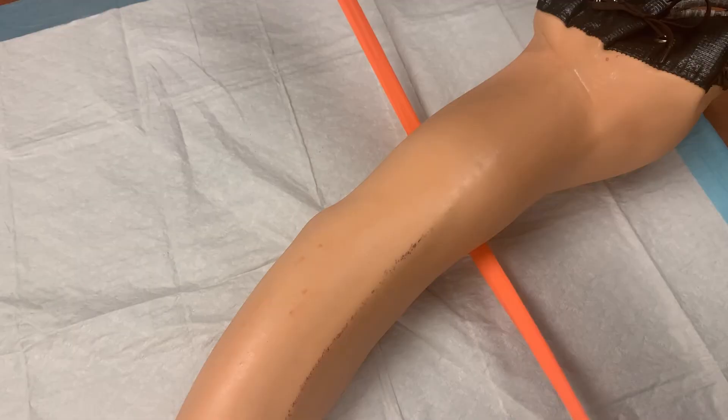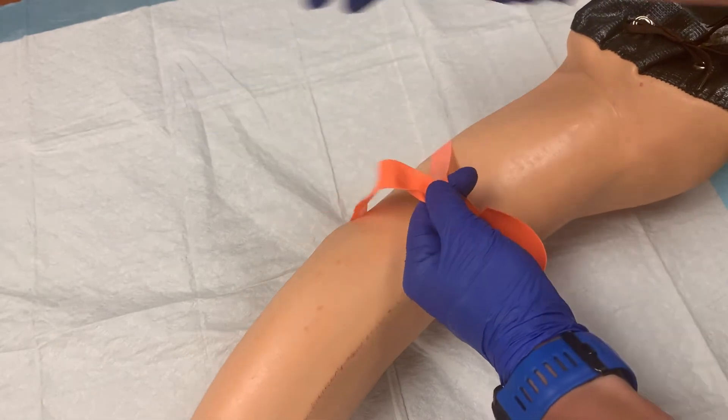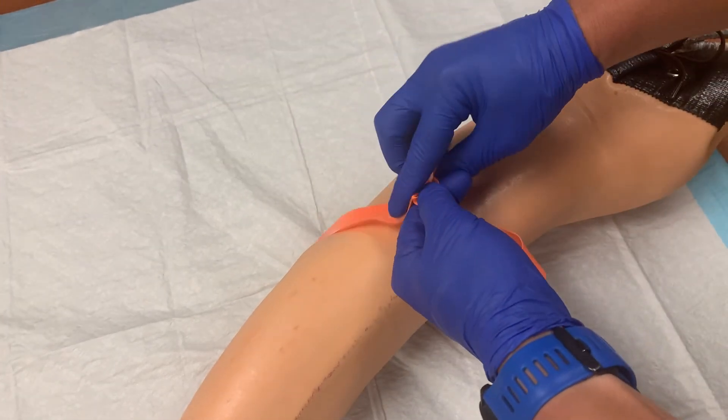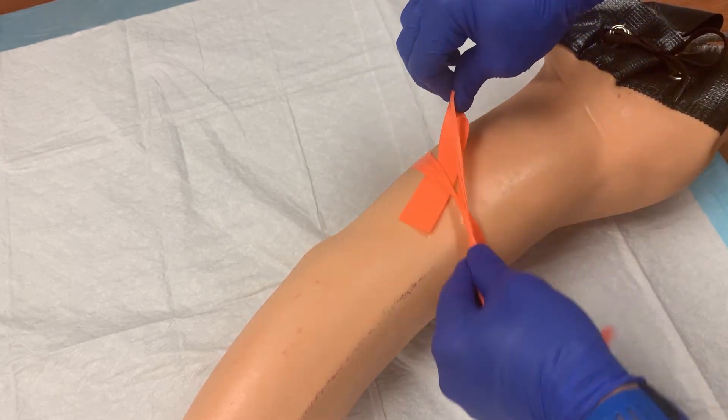To place the tourniquet, slide it under the patient's arm, then stretch it up and cross the two sides. Hold them together with one hand, and with your other pointer finger, push the middle of one of the ends of the tourniquet under the part that is squeezing the arm.